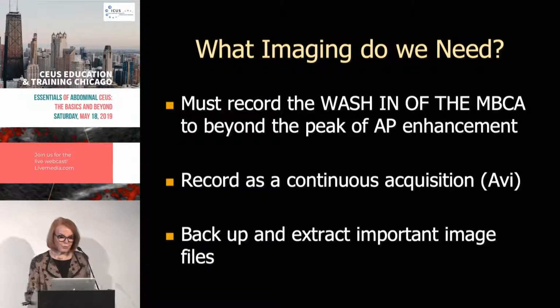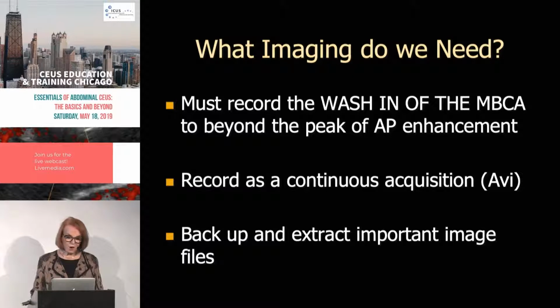Now, what imaging do we need? The wash-in, and then record as a continuous acquisition. You'll see in the other presentations that I give, I really pride myself on taking the most beautiful pictures. What I've learned over time is that the beautiful pictures that we take, we don't take them by doing a lot of it. The machines today, you can take pictures on the fly. But taking pictures on the fly from contrast is not as good as taking grayscale pictures on the fly.